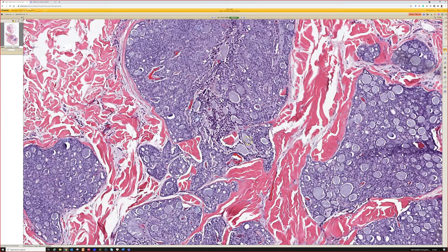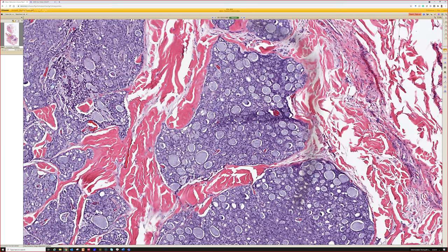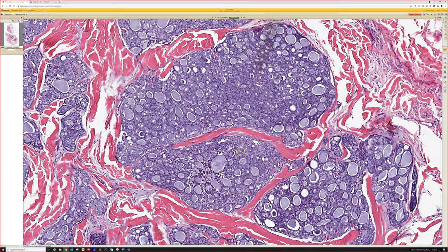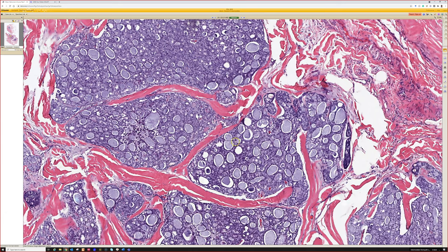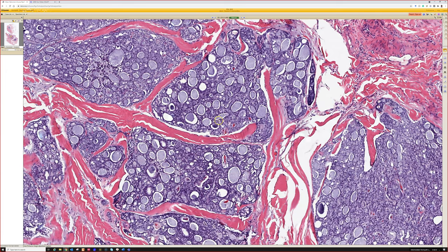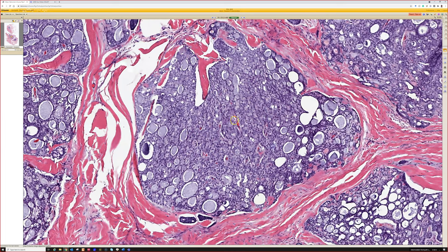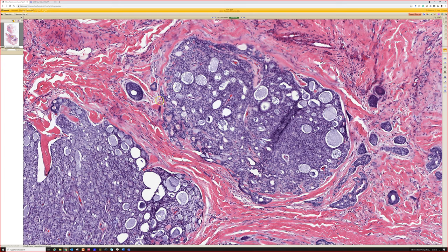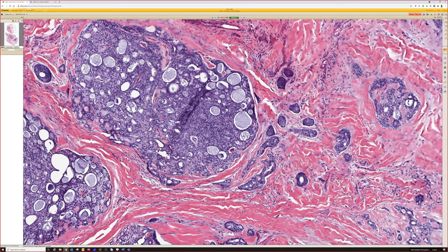Also, these tumors stain with SOX10, and I think another stain called MYB, M-Y-B, stains these. I don't have much experience with salivary gland pathology, and I've only seen a handful of these in practice, but I believe that's another stain that can be used. So there are some stains that can be done to help confirm the diagnosis if needed. I think SOX10 is readily available and tends to stain the vast majority of these, whereas it should be negative in a basal cell carcinoma. So a really rare bird.